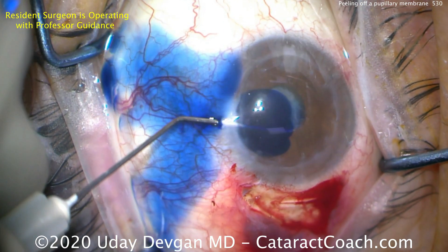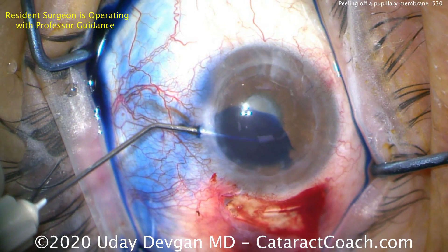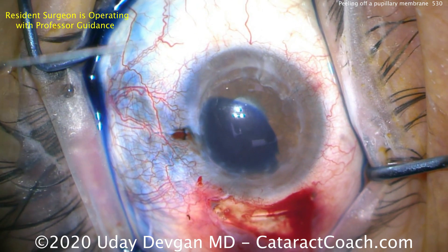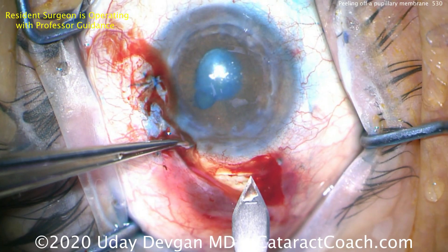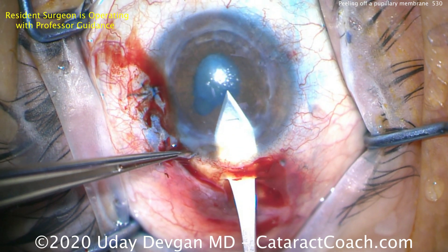It's very important to inject this trypan blue dye onto the lens capsule, not onto the pupillary membranes. We went underneath the iris here, injecting a sufficient amount of trypan blue dye to stain the lens capsule — we're not trying to just stain the pupillary membrane, which is why it's important to get under there. Now making a scleral tunnel incision; we want to avoid touching this cornea.